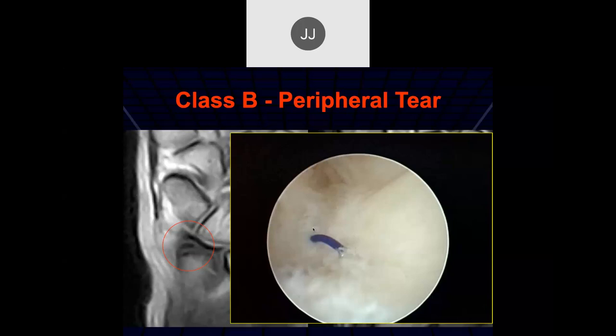It looks pretty frayed — I wonder how well that would hold. It does look pretty frayed to me.